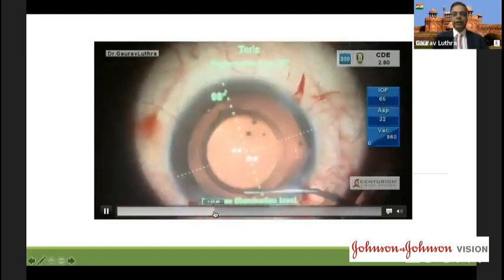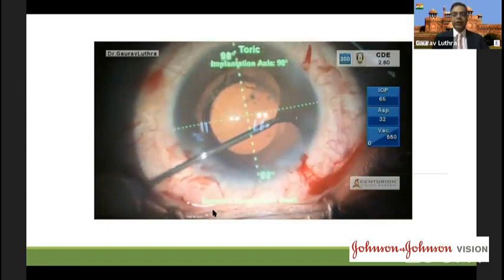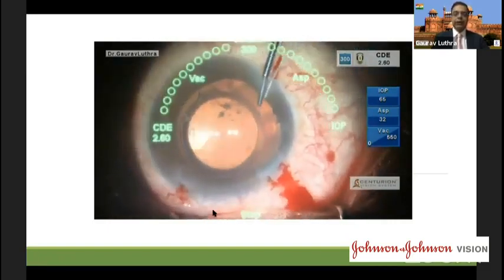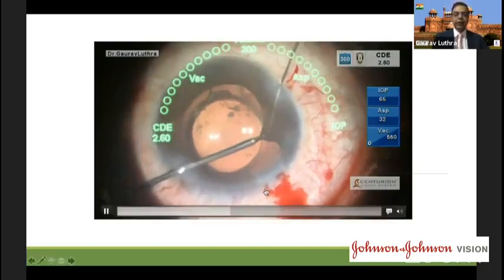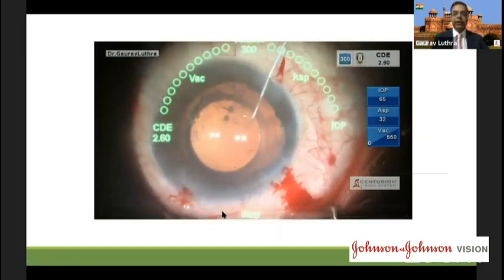And once the lens is nicely there, we are trying to put in pilocarpine to see if the pupil constricts, it does not. So we decide to do a single pass four throw pupilloplasty. So this is one of my first videos. That's why you can see that I'm taking the 10-0 Prolene needle aided by a small instrument to direct it there. But frankly, you don't need this. You don't even need an MVR entry now.